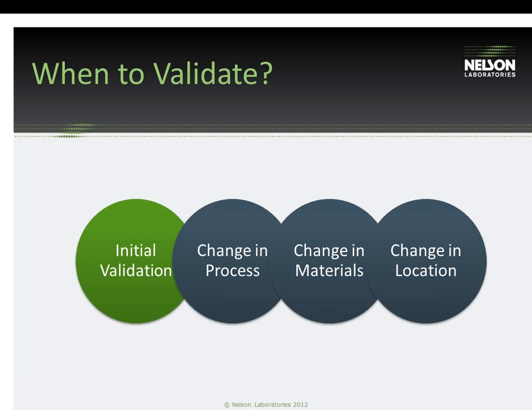Maybe an extra step was added, a change in material to either the device or a new component in the process as well, or a change in location. Even if all the steps in the process remain the same and you just move locations or maybe add a new vendor, we recommend revalidating or retesting just to make sure that there are no other contaminants that were introduced with this change that could be a problem for your device.